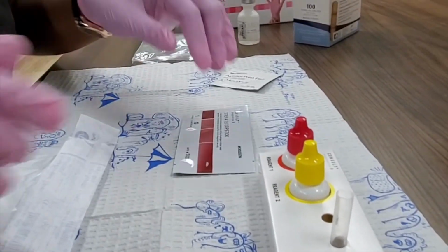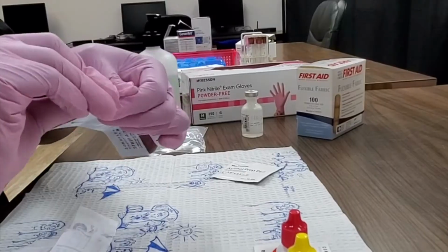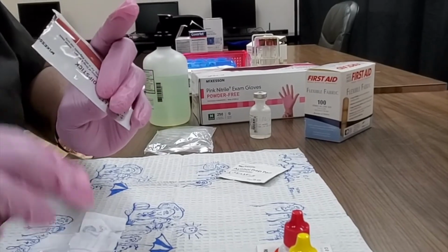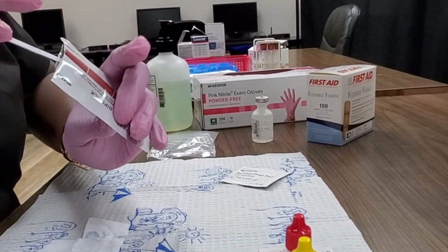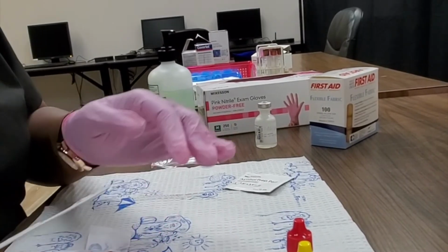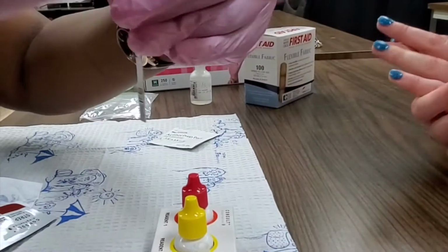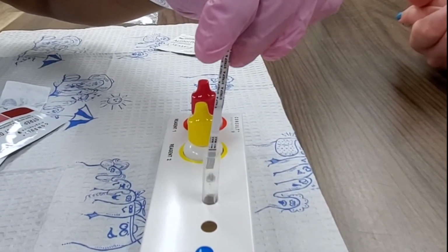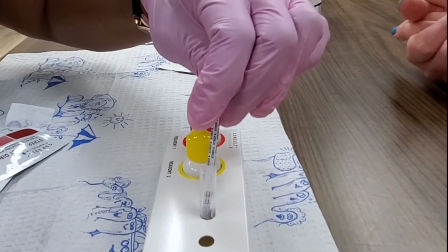We're going to open our package. And our reagent strip will sit inside of the plastic tube. It has markings on it. The markings go down. They're like little arrows. Okay. This test will take 5 minutes to read.